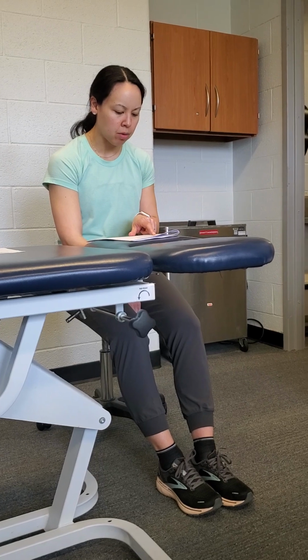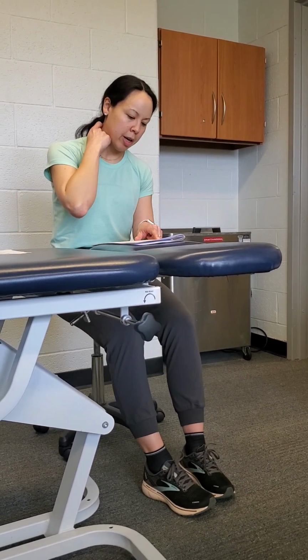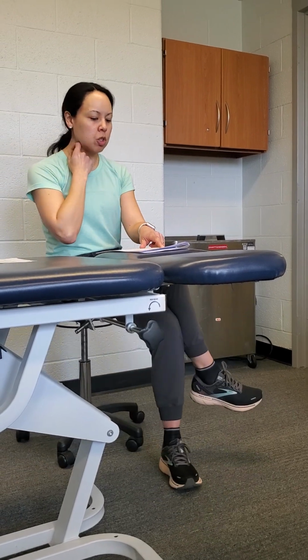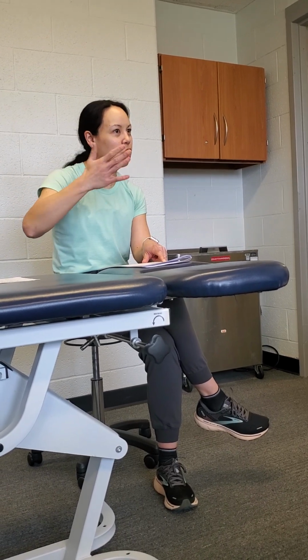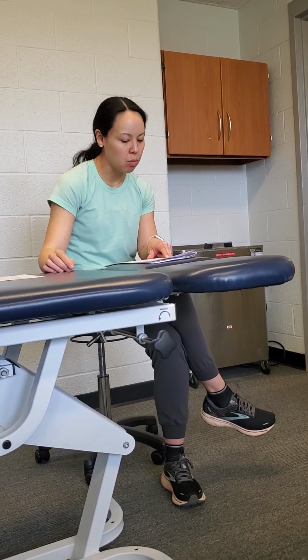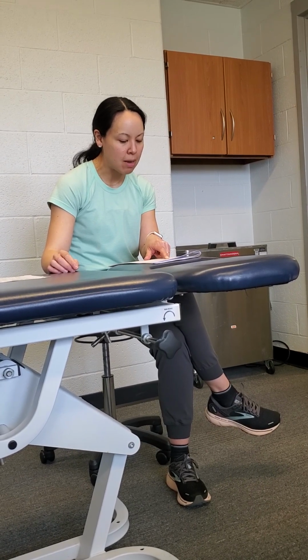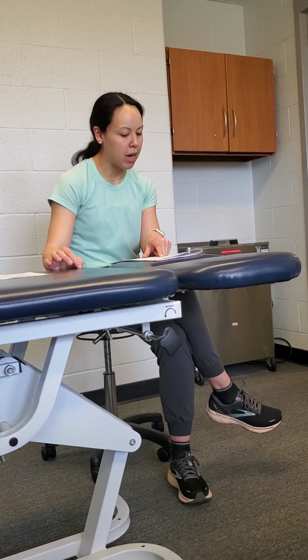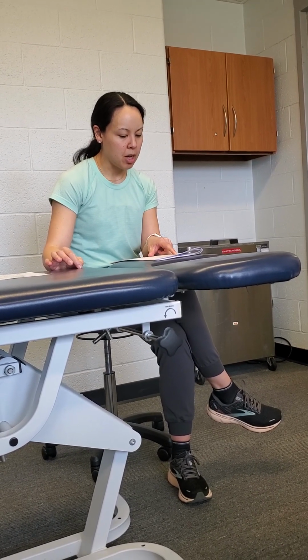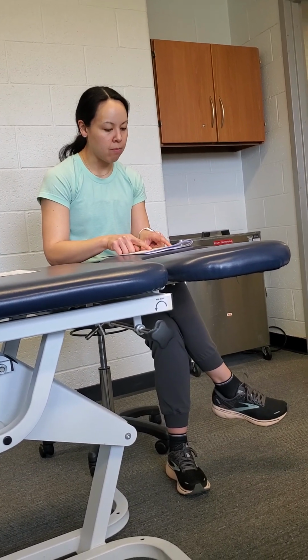It also talked about upper extremity. It said 40% of limb occlusion pressure, which is pretty typical for upper, and they didn't really know what the top range was, but they said 40% is generally where you use it. The intervals are a little bit different: 5 to 8 minutes on, 1 to 3 minutes off, and you do 3 bouts of that. Again, generally 2 to 3 times per week for 2 weeks.